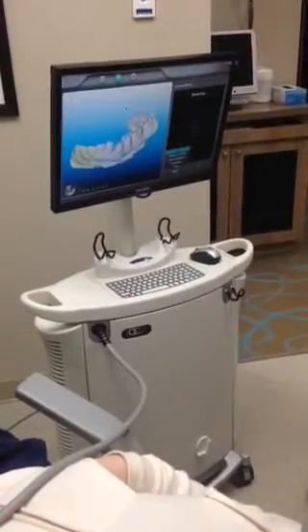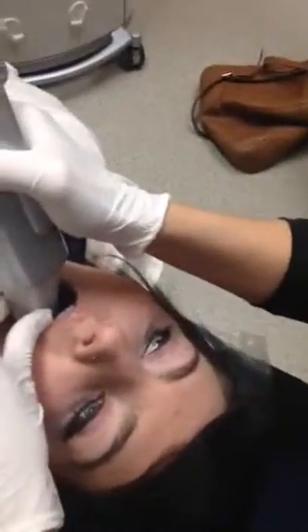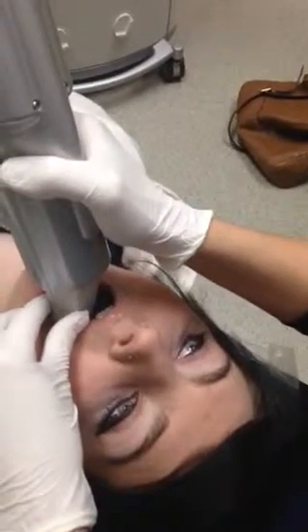Alright, so once you get to the center, I'm just going to push the foot pedals again, go to the next section here, open wide. And just try and keep your tongue to the other side. Awesome.